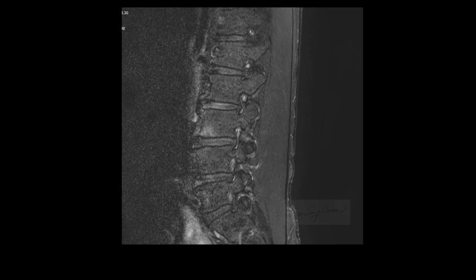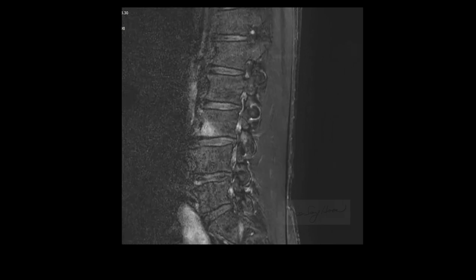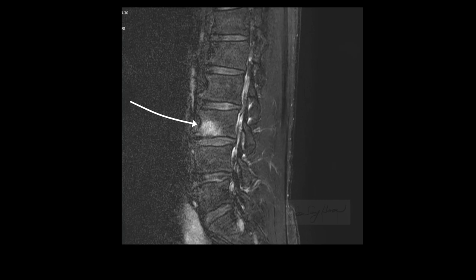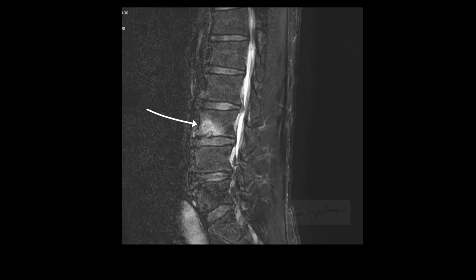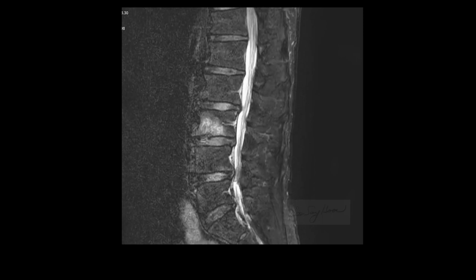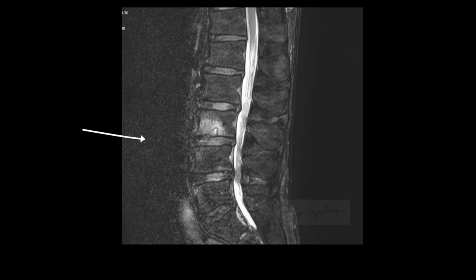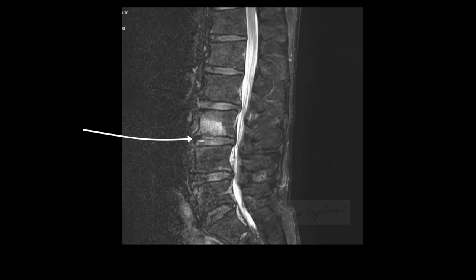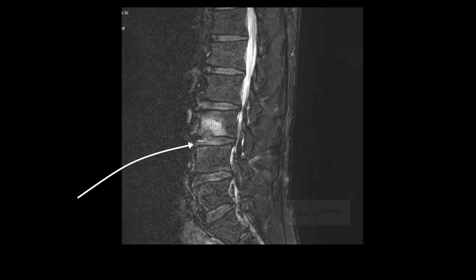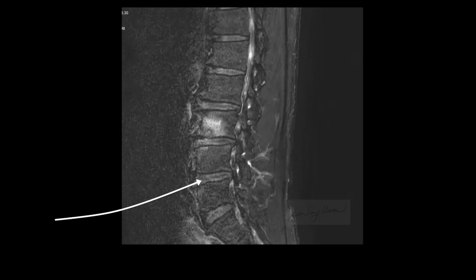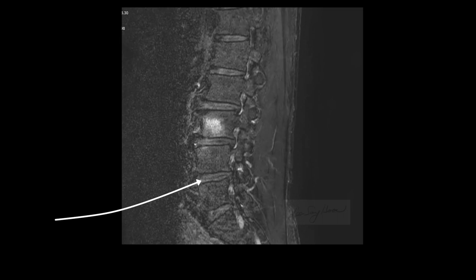This is a sagittal T2-weighted water-only image. There is diffuse high signal intensity of the bone marrow of the L3 anterior body. There is cortical disruption of the anterior end plate of L3 and transverse high signal intensity of the L3-4 intervertebral disc. A high signal intensity of the L4-5 disc and Type 1 Modic change is noted at L4.